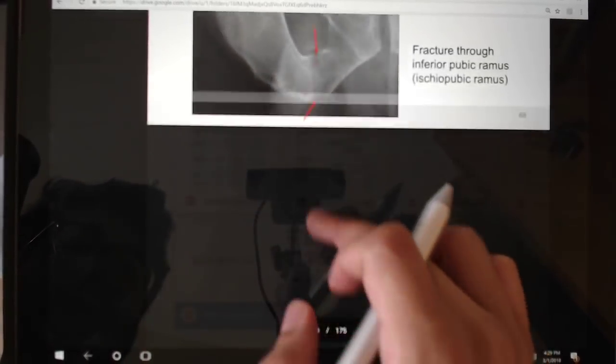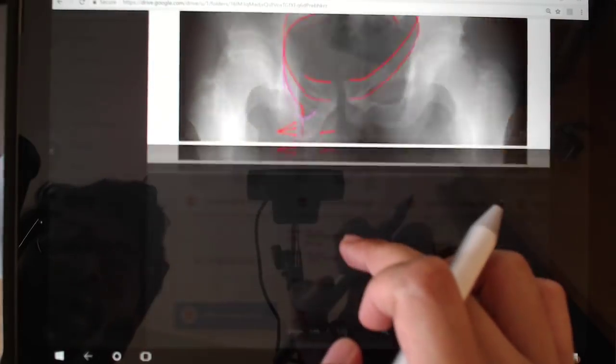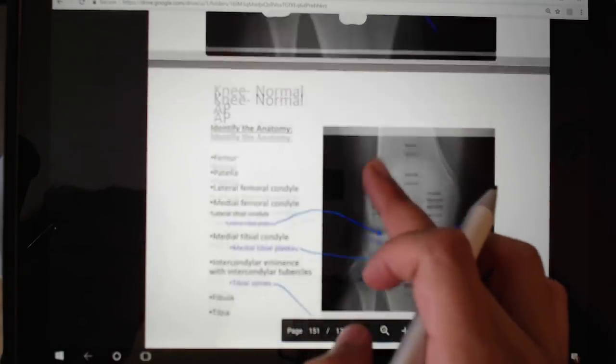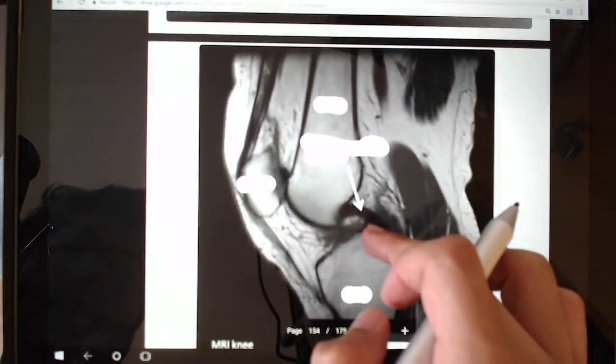But yeah, I don't know if that was helpful or not, but hopefully you can sort of tell what's going on based off of these types of things. I wish I had a better way of doing this, but yeah.